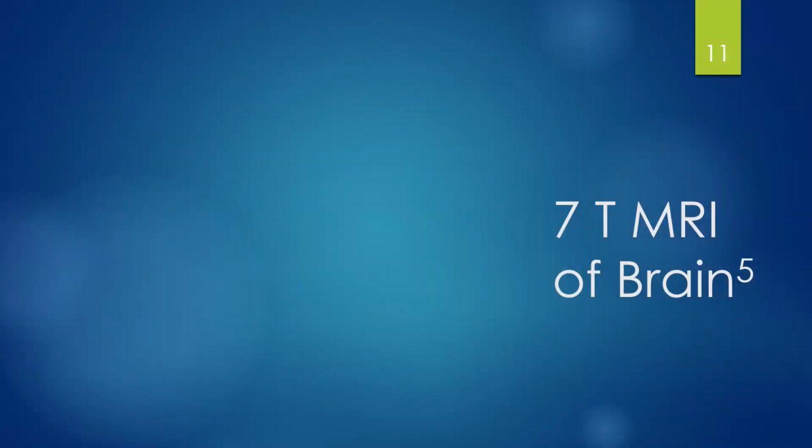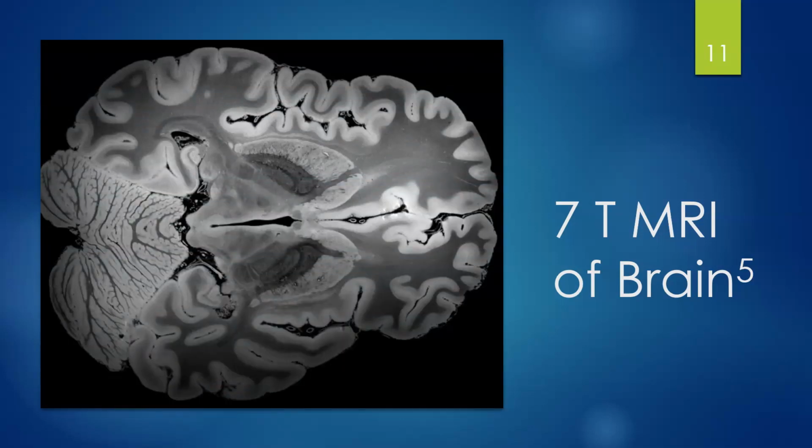As I mentioned before, there are 7 Tesla MRIs that exist. And recently, there have been some published images from some studies done with a 7T. This is an image of a patient that was deceased, because once again, a living person really can't be around an MRI of this strength for more than about 15-20 minutes. So this patient was deceased, and this scan took 100 hours, and thankfully the patient was able to remain completely still.